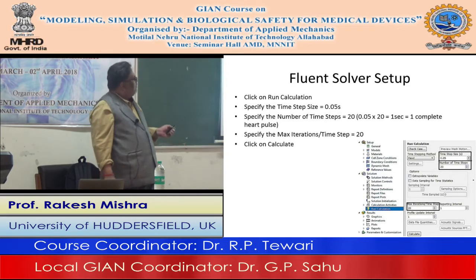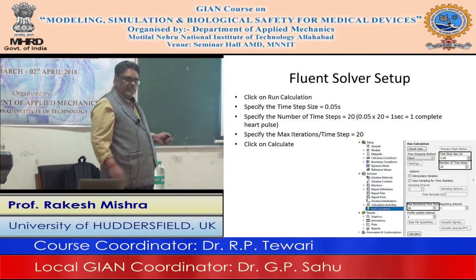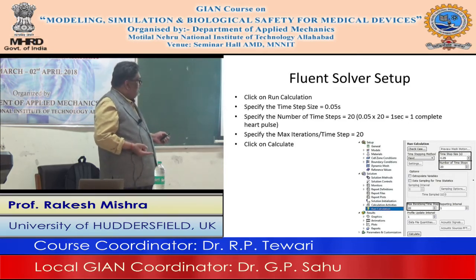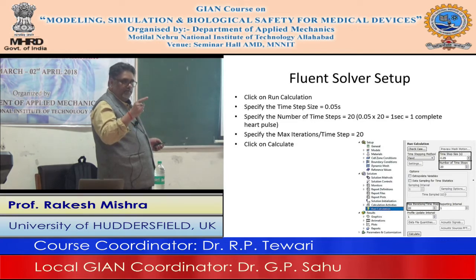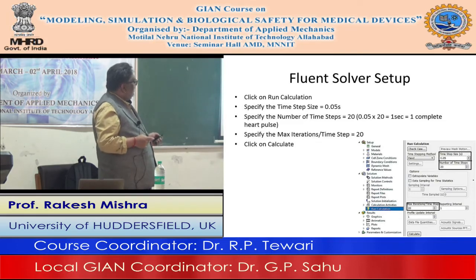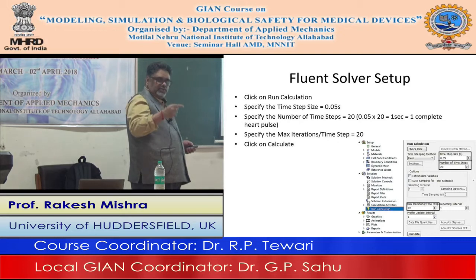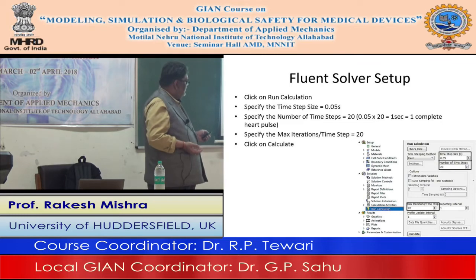And then how many time steps am I taking? 20 time steps, because I am simulating only 1 second of flow, total 1 second of flow through my arterial bifurcation. So it will run 20 simulations at every 0.05 seconds. Okay, and I am specifying the maximum iterations per time step to be 20. So for every time step we will have 20 iterations. Now for better accuracy you can have 50 or 100 or 1000, depending upon how accurate results you want. We are doing it for 20 time steps in this particular case, but you can take higher as well.